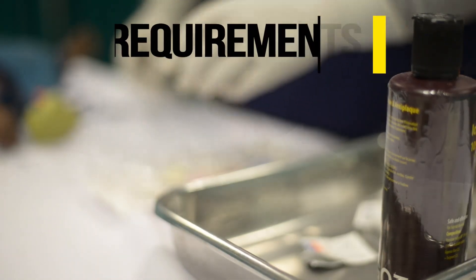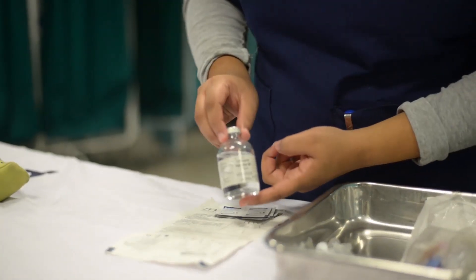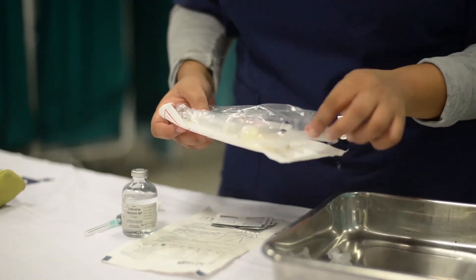Requirements needed: sterile gloves, alcohol swabs or povidone preps, 2% lignocaine without epinephrine, saline flush, and a sterile blood-giving set needle.